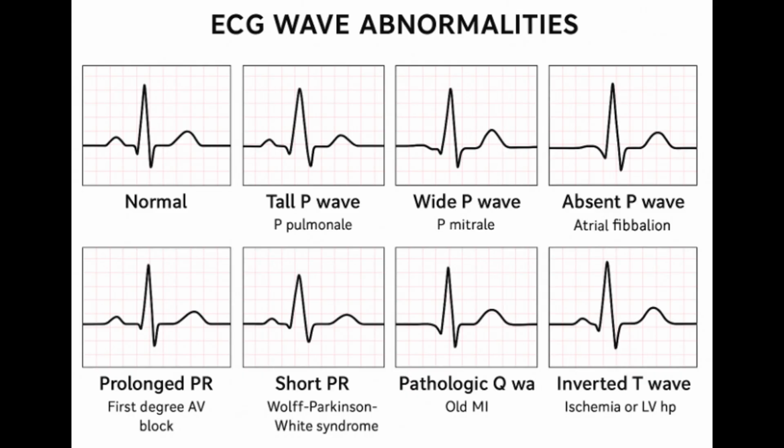Low potassium, hypokalemia. That delays repolarization. What does that look like? So with low K plus, the T waves do the opposite. They flatten out or can even invert, go downwards. But the real hallmark is often the appearance of a U wave. A U wave, what's that? It's another little bump that appears after the T wave. So the classic look is sometimes called the two humps. You see the QRS, then a flattened T wave, then this prominent U wave right after it.